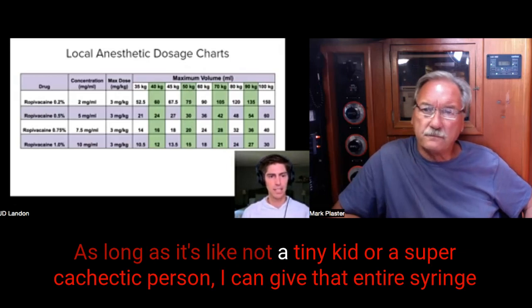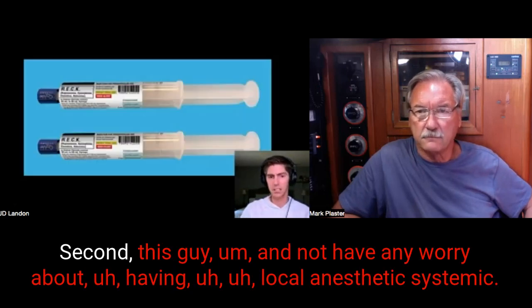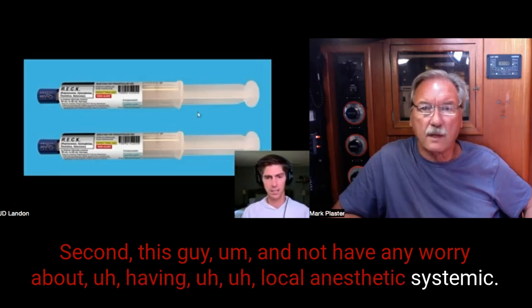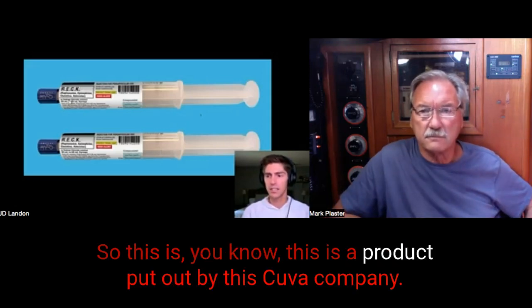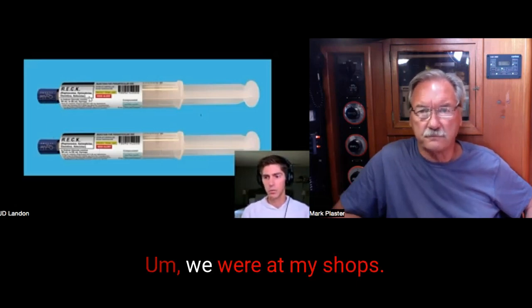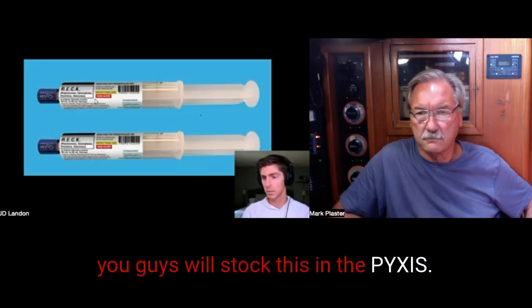As long as it's not a tiny kid or a super cachectic person, I can give that entire syringe that I'm going to show you here in a second, and not have any worry about local anesthetic systemic toxicity. Correct. So this is a product put out by this company. At my shop, we're just lucky enough that for whatever reason the hospital system's like, yeah, we'll stock this in the Pyxis, and so it's amazing.